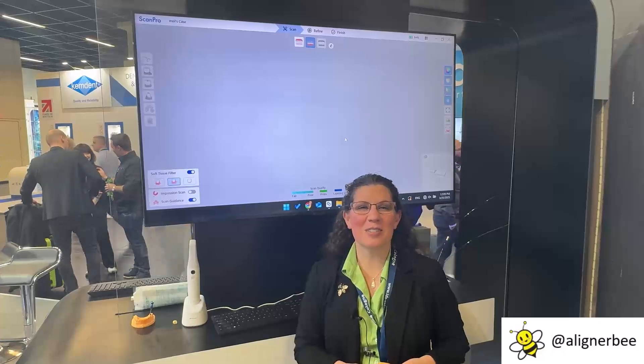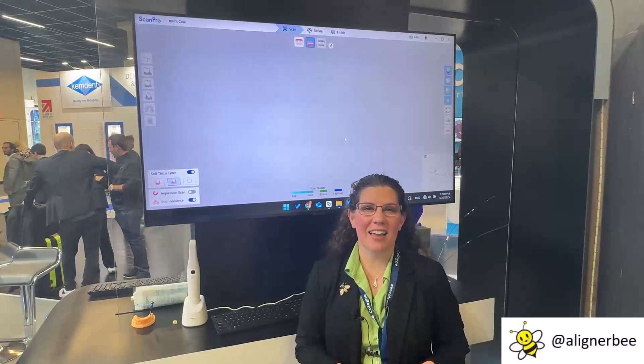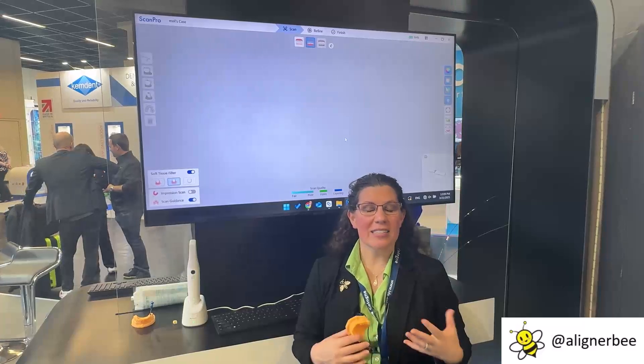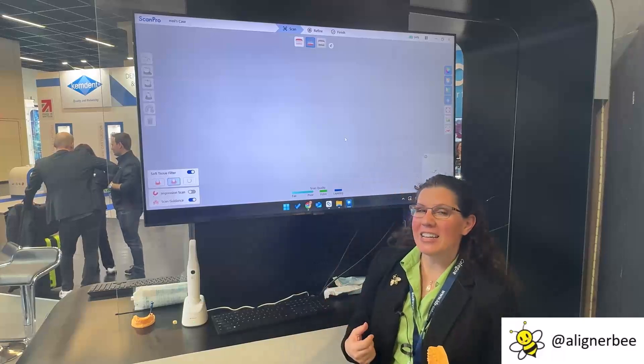Hi, this is Dr. Melissa Schottel, and I'm here in Cologne, Germany, and I've made my way to the Allied Star booth. I stopped by to check out the new intraoral scanner, so let's go ahead and take a look at it.